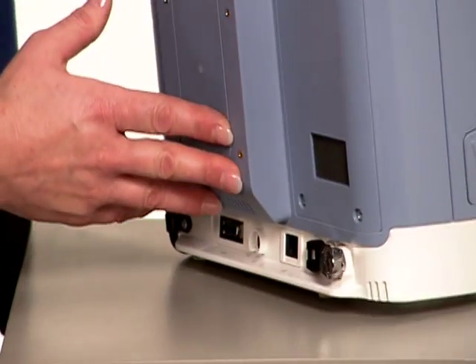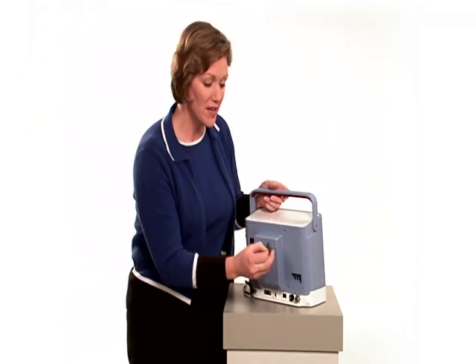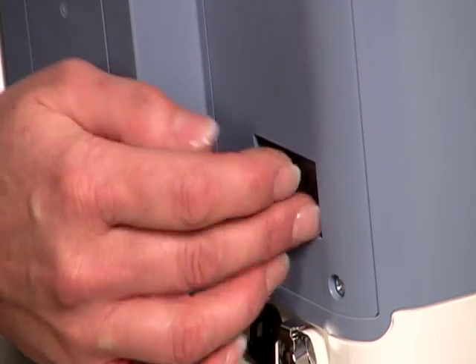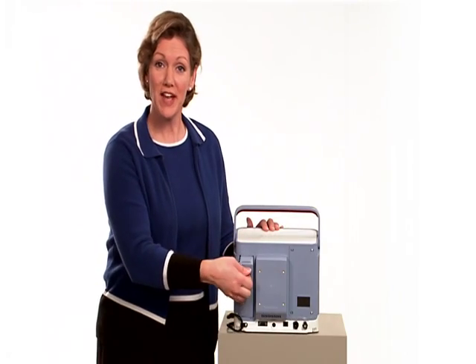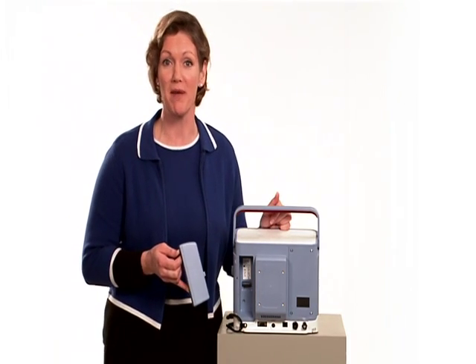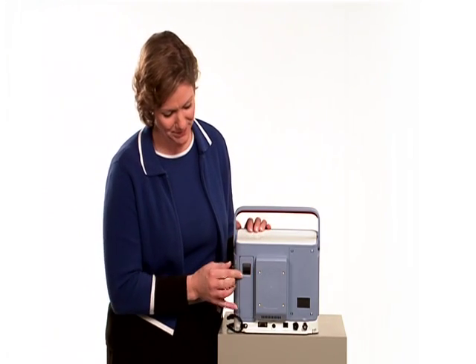On the back of the Trilogy, you'll see an air inlet, which holds a gray foam filter. The filter, which screens out normal household dust and pollen, is washable and reusable. You must have the filter in place when the device is operating. On the other side of the ventilator is a detachable battery pack slot. A lithium-ion detachable battery pack is used to power the device and attaches here.